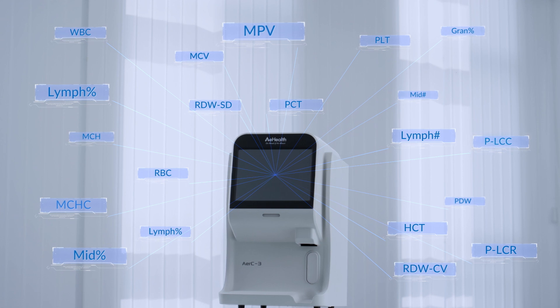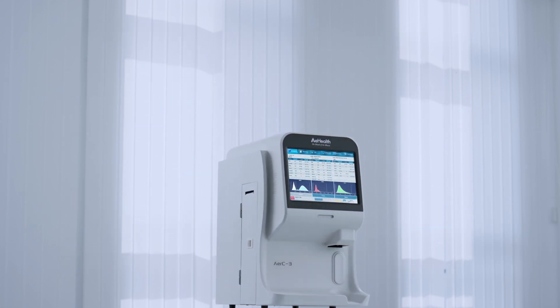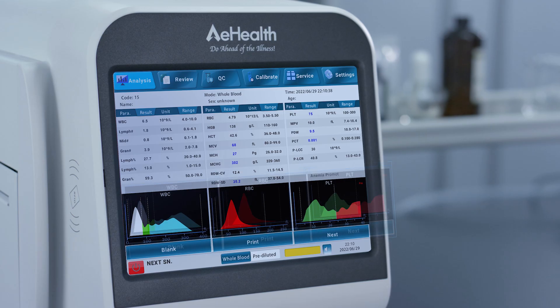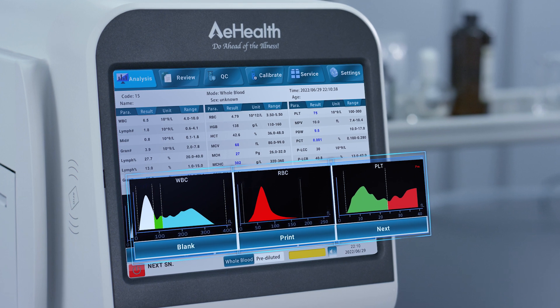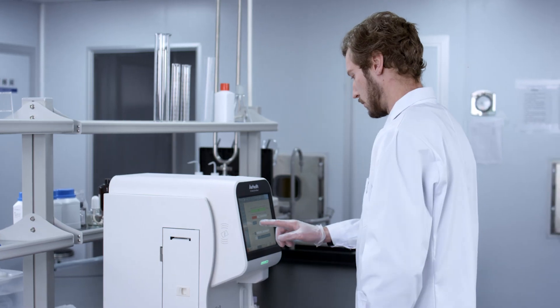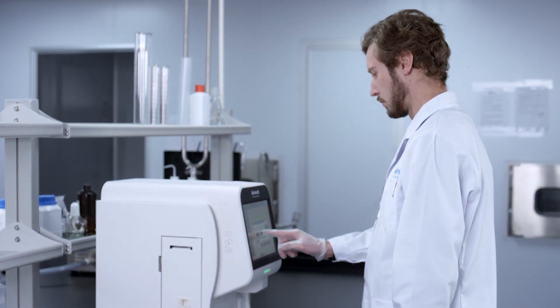21 parameters and 3 histograms are provided when the test is complete. Anemia samples can be reported and flagged. If the histogram of the test is abnormal, the system will generate a histogram alarm. Patient information is easily stored and retrievable, with up to 50,000 records.